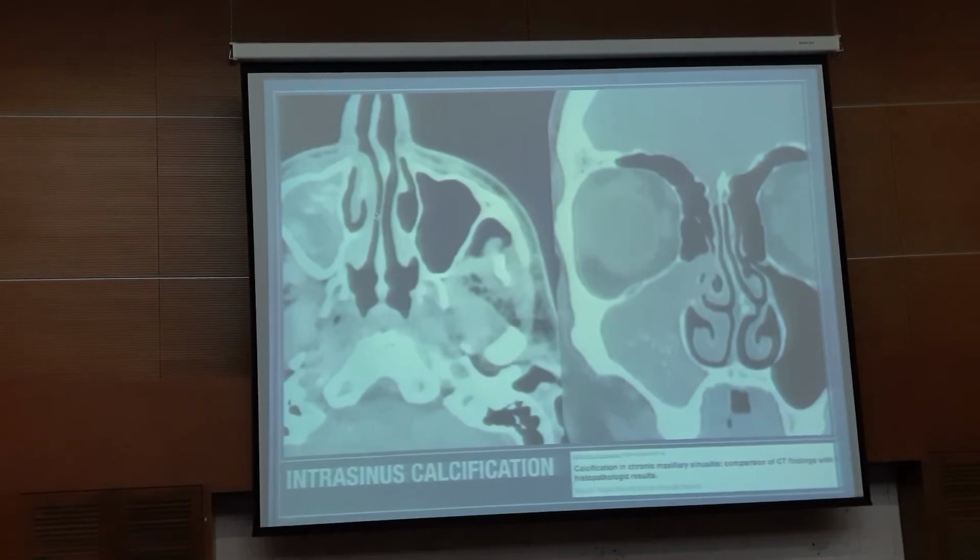Intrasinus calcification is also very interesting. A lot of radiologists will tell you straight away, if I see calcification, it must be fungal, because we are taught that mycetomas calcify. But in actual fact, you can get calcification in non-fungal infections. There are papers that talk about the patterns of calcification and whether or not they tell you that it's fungal.